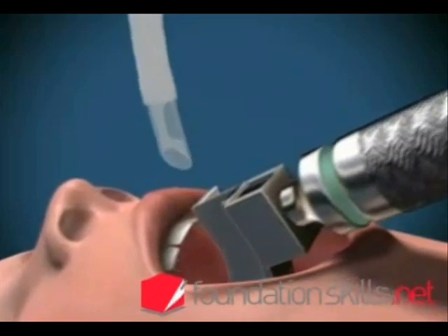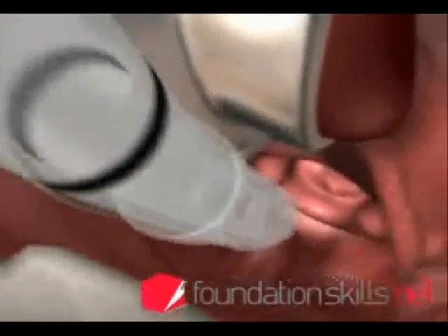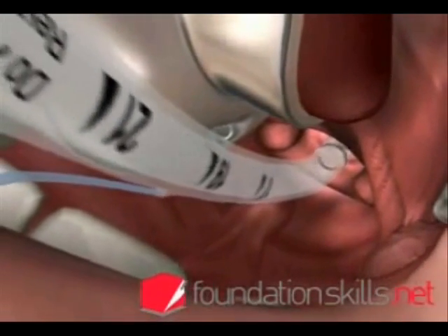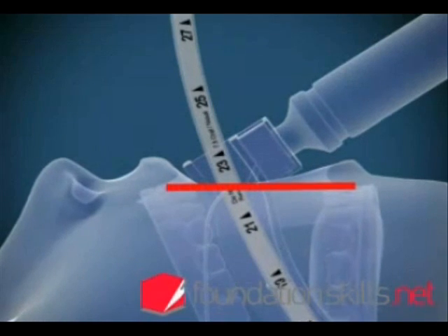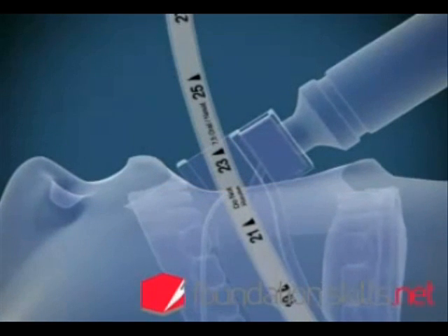With the right hand, insert the endotracheal tube from the right hand side of the mouth directly between the cords and into the trachea until the cuff passes through the cords. The markings on the tube at the incisors will show between 21 and 24 cm in the average sized adult when the tube is in position.